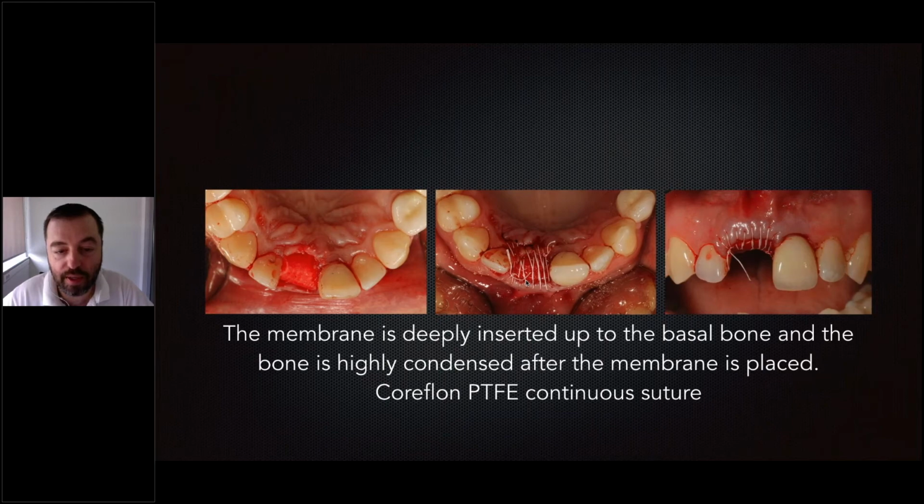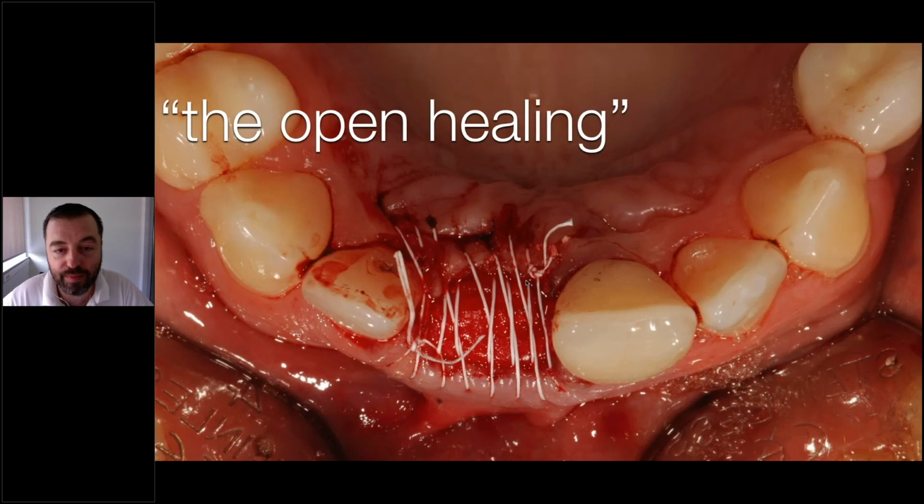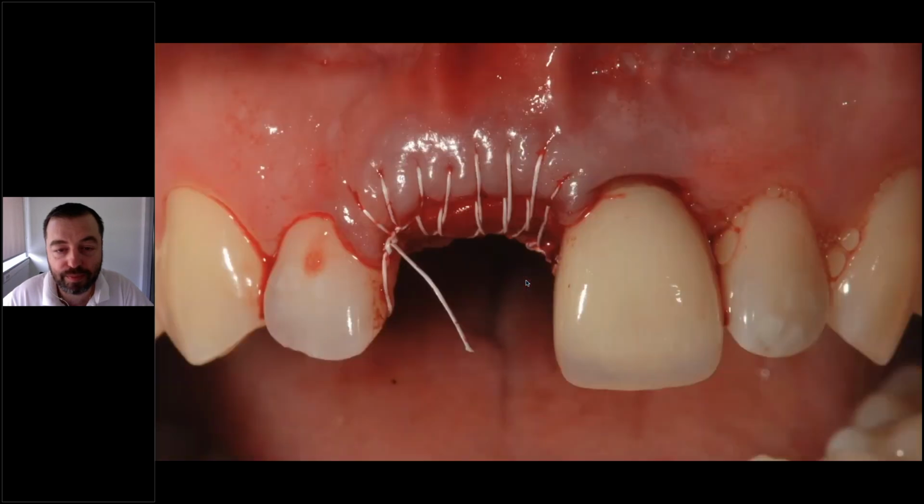So this is immediately after the surgery, and it is usually from neighbor teeth, and we use rubber dam when we attach it, not to have any composite going to the surgery site. So this is how it looks like, and this is a good outcome.